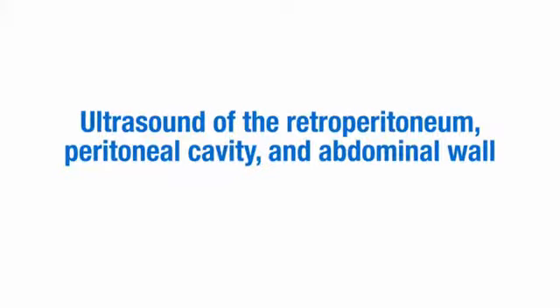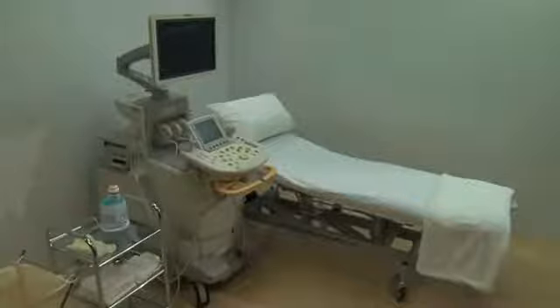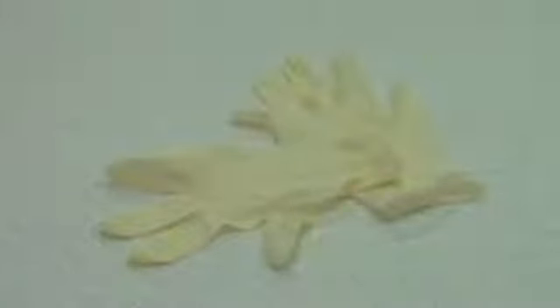This video demonstrates how to set up and perform an ultrasound scan of the retroperitoneum, peritoneal cavity, and abdominal wall. Equipment required includes the following: an ultrasound machine, a selection of transducers, an examination table, positioning aids such as wedge sponges or pillows, a chair, acoustic gel, examination gloves, bed linen and towels, and a sonographer's worksheet.